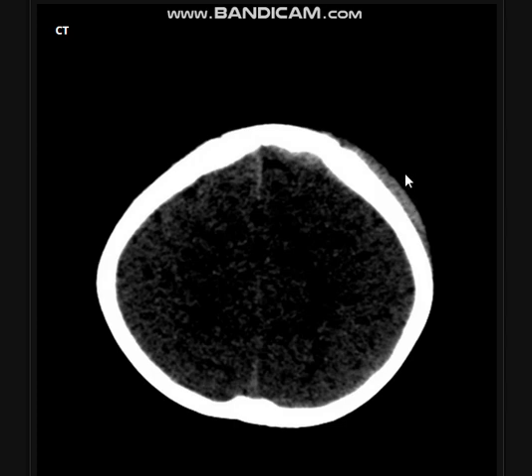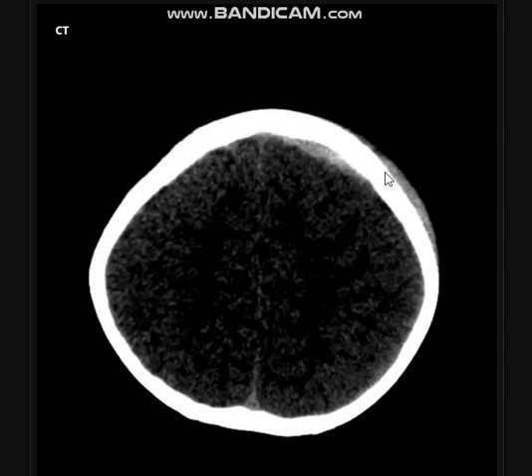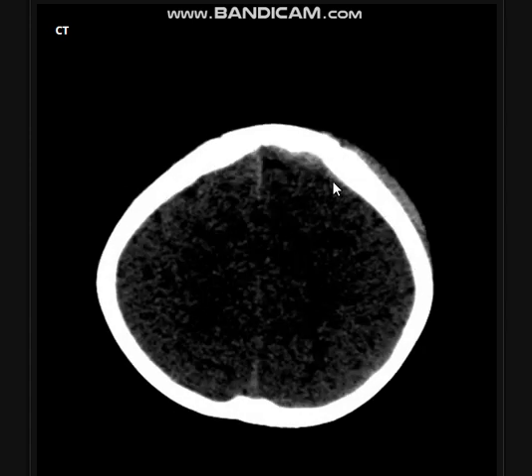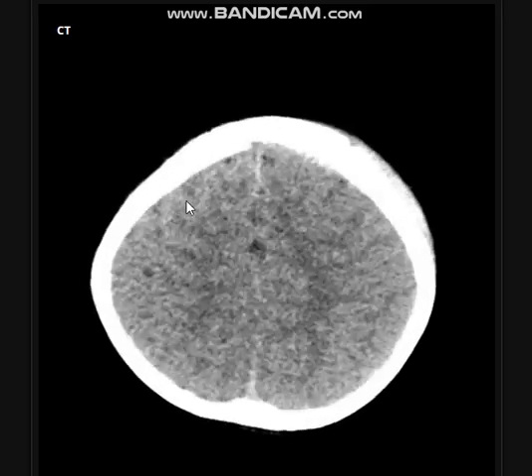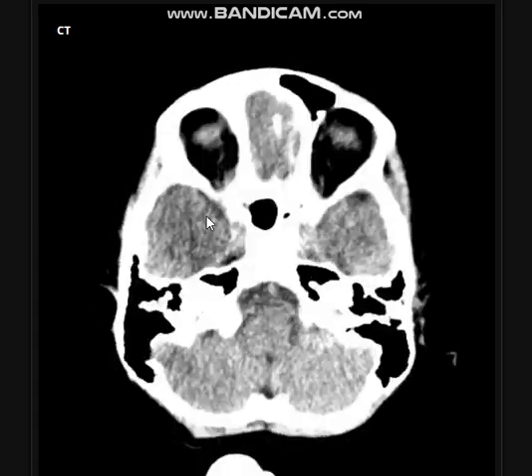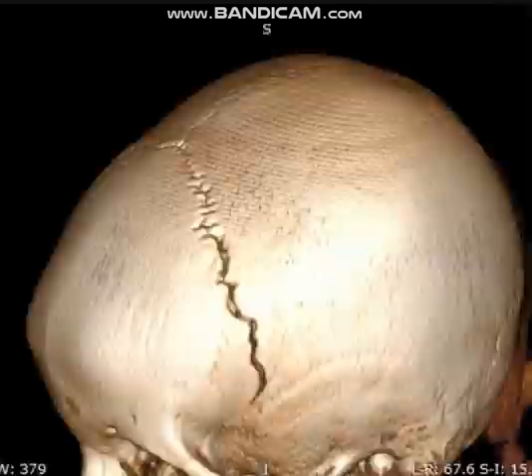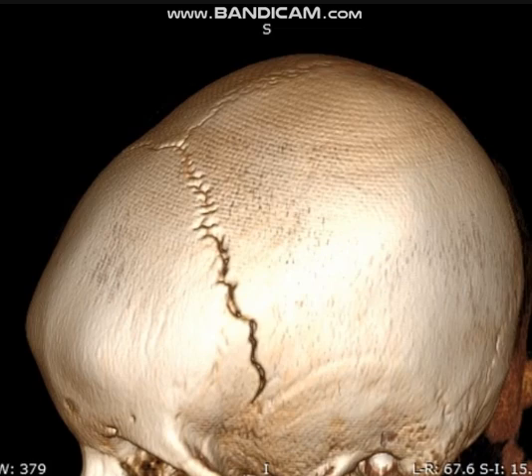That's why I always say you have to check all the layers of the brain from outside to inside: the scalp, the skull, the dura, the meninges, the brain, the ventricles, and finally exclude cerebral edema and brain herniations. Here we also have left frontal subgaleal hematoma and left frontal small epidural hematoma, with the rest of the brain appearing unremarkable.